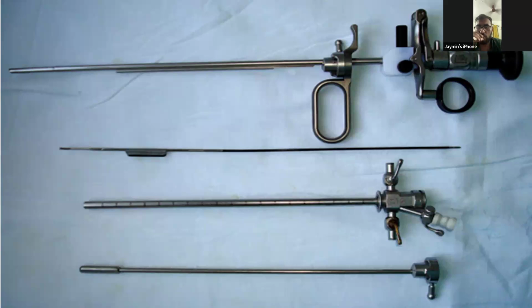Based upon the length and dimension of the stricture, once we have decided that we are proceeding with the VIU, we will park a guide wire across it. With the 0-degree telescope and the blade inside, the VIU cuts can be given at the 12 o'clock position, sir, till the fibrotic area has been cut and we see some mild oozing, and we are able to progress ahead proximal to the stricture.